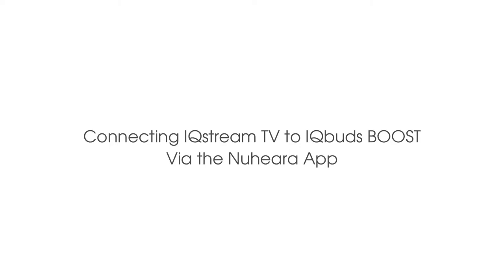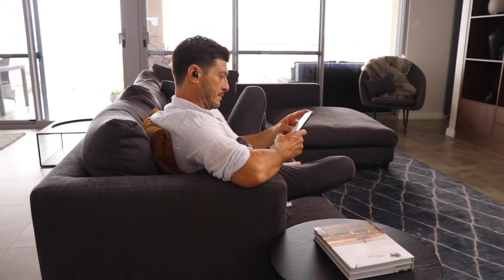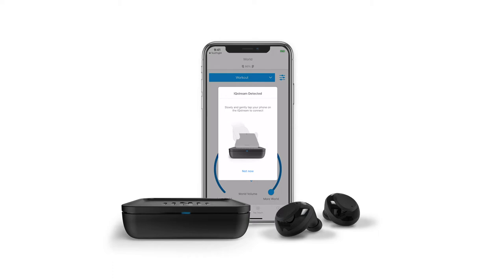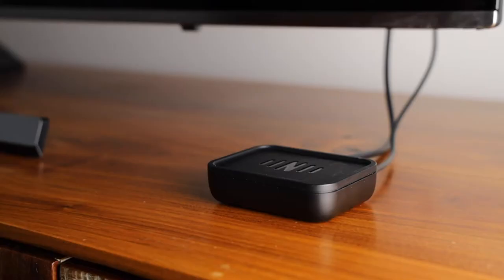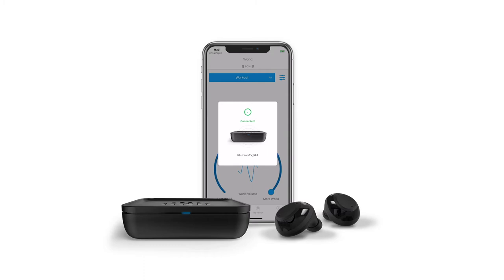Connect into the app. Once the IQ Stream is connected, you may connect your IQ Buds to your phone or tablet and open the Nuheara app. Your IQ Buds Boost will require the latest firmware for use with IQ Stream TV. Ensure this is installed on your IQ Buds before you begin. You can download the installer from the address on the screen. When your IQ Buds Boost are connected to your phone, you will receive a pop-up message requesting you to tap your phone on the IQ Stream. Hold your phone or tablet on the IQ Stream until you see Connected. If you didn't see this pop-up, you may need to update your app. Go to the app store on your phone or tablet to do this.